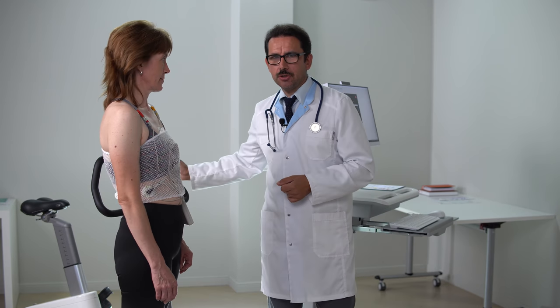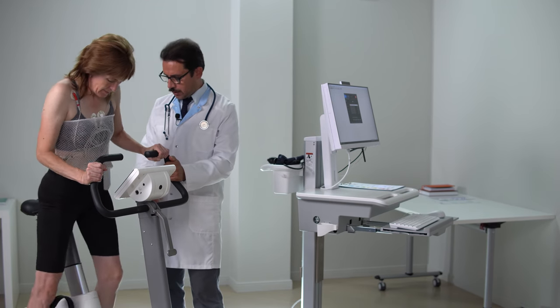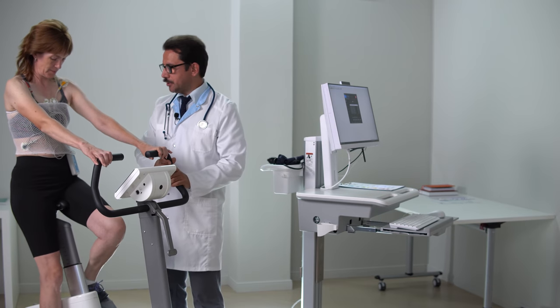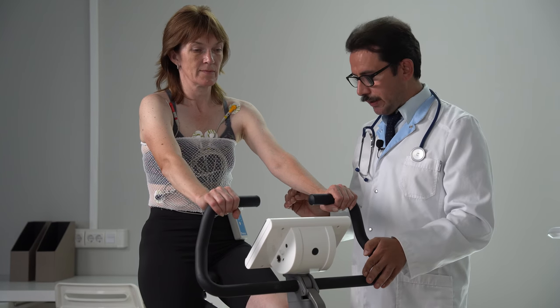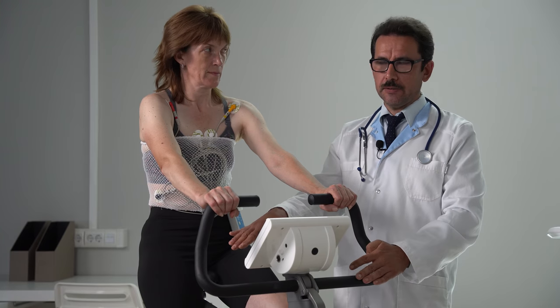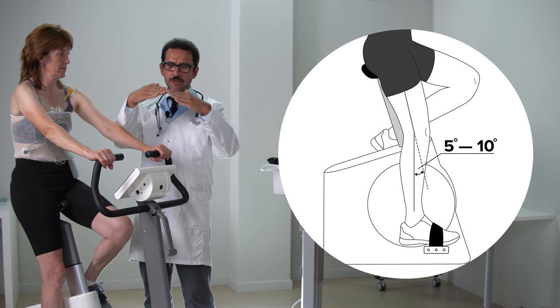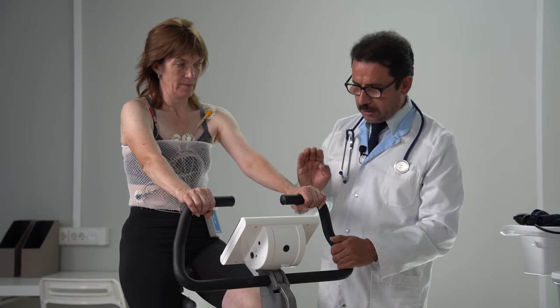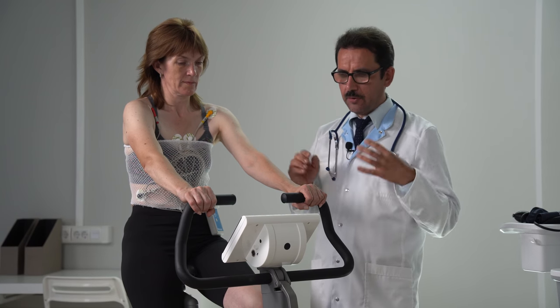So now we ask our patient to move to the bicycle. Please sit here. And we need to check the position. The handlebars should be positioned to provide the patient with comfortable sitting, so sitting straight, holding the bars. The height of the saddle is set to give the patient the ability to almost straighten the leg in the lowest position of the pedal. Not 180 degrees, not a straight line, but with a little bit of angle, about 5 degrees, so 175 degrees. It will allow the patient to push with enough power. It will be very important during the high load to transmit all the power of the patient to the pedals.